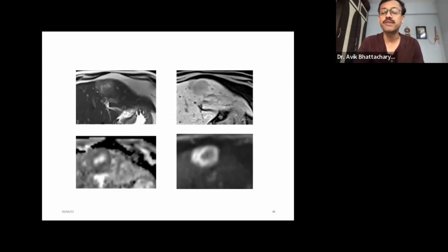In a setting of acute pancreatitis, to deal with the peripancreatic lymph nodes, whether those lymph nodes are reactive or metastatic, whether it is a neuroendocrine tumor, or a focal intrapancreatic pseudocyst or some other lesion in pancreas, to characterize the different types of liver lesions. So in all areas, diffusion plays a huge role. Even in MRCP, in all MRCP patients, we take a diffusion weighted image.